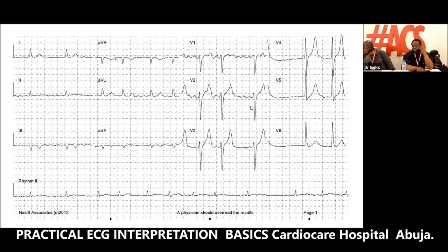Somebody asks, how reliable are automated ECG readings? When you see the reading, you will see it says confirmed by the physician. So automated ECG readings are not reliable. You should confirm; not everything written by the machine is correct. You have come for this course, so beat your hand on your chest and say, I'm from ACS. Cancel it and sign it. If you're not sure, ask for help. I think we've answered all the questions.